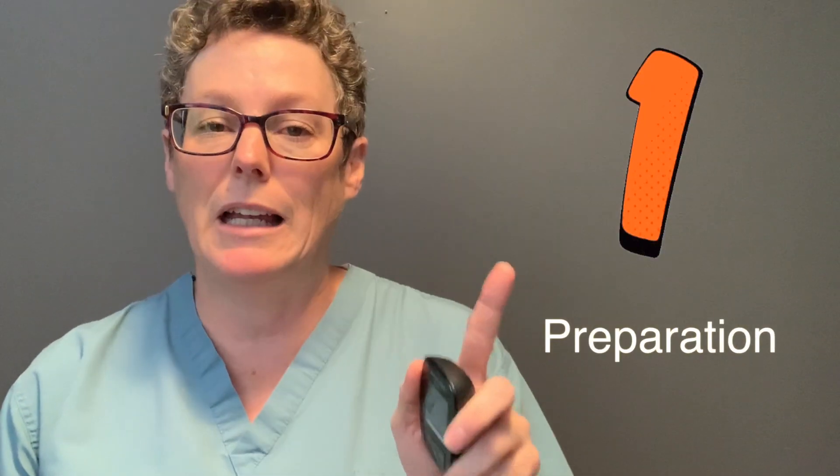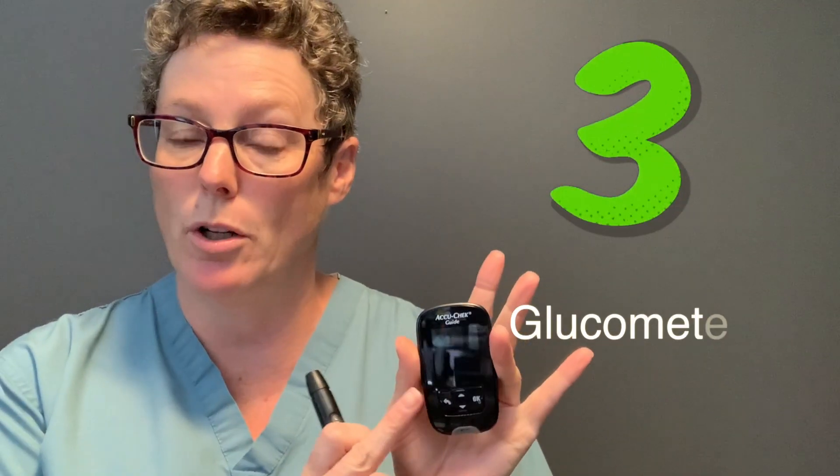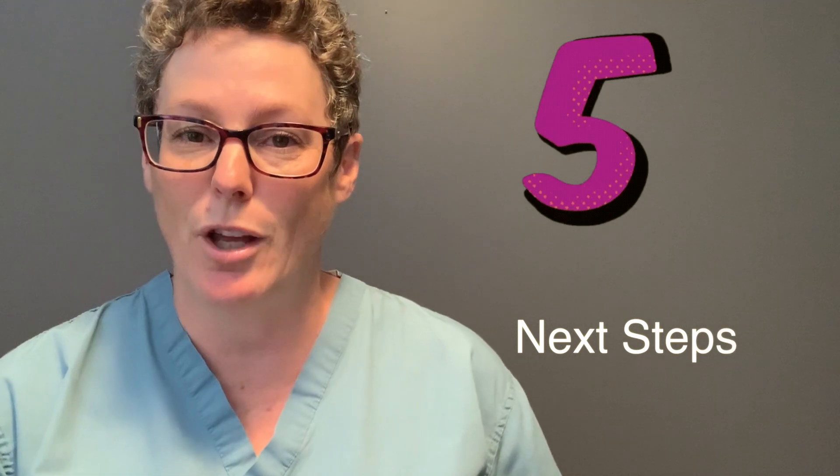Taking a blood glucose test is not that difficult, but there are some important things to note. Number one is preparation — getting ready for the blood test. Number two is the lancing device and getting that ready. Then we'll look at getting your glucometer ready to accept blood, actually obtaining a blood sample, and what to do after you get those readings.